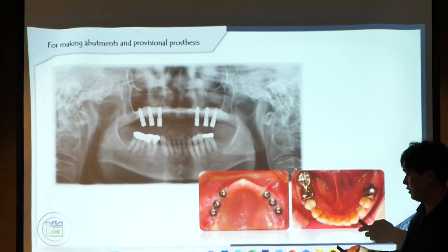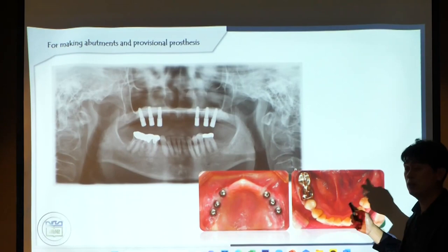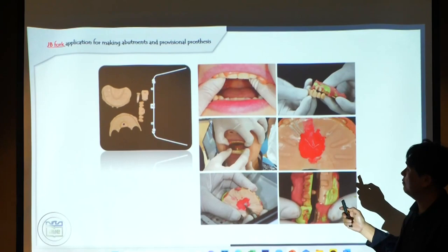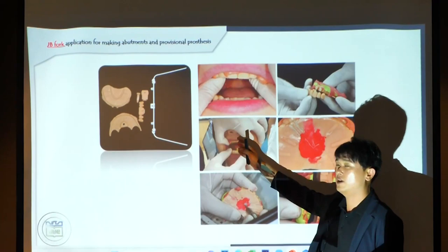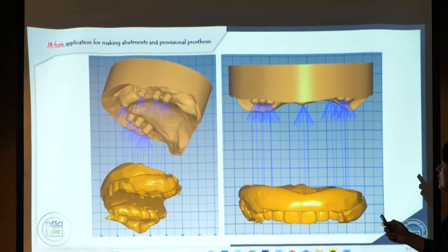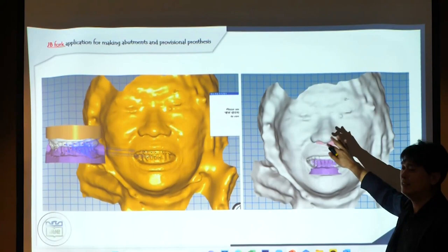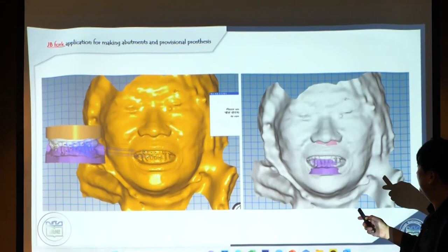I decided to do early loading. At that time, I applied the JB fork directly and discussed the position of the anterior teeth with the patient. She didn't have any experience of having anterior teeth, so I needed several discussions, and then merged the data together. I opened the exocad file. Originally the figure was good.